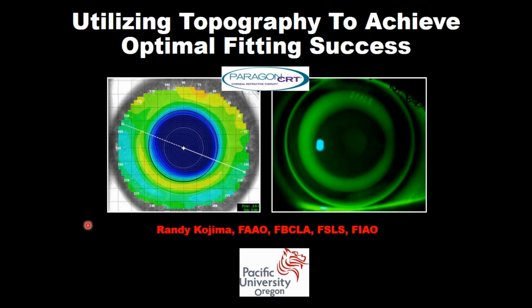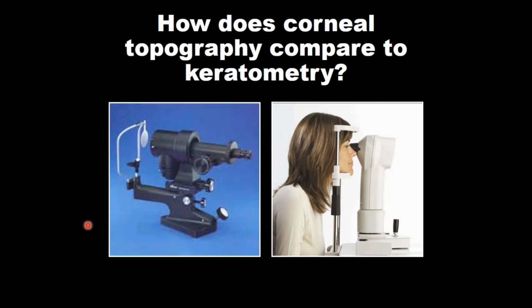Hi everyone, thanks so much for joining us today and for listening in on this great topic related to orthokeratology. And topography is one of those tools that we all know is absolutely critical for the practice of specialty contact lenses and especially orthokeratology in the CRT design. So this talk should be about how we can use the topographer with the CRT system and orthokeratology in general, and we'll hopefully give you some pearls that you can use to take back to your practice.